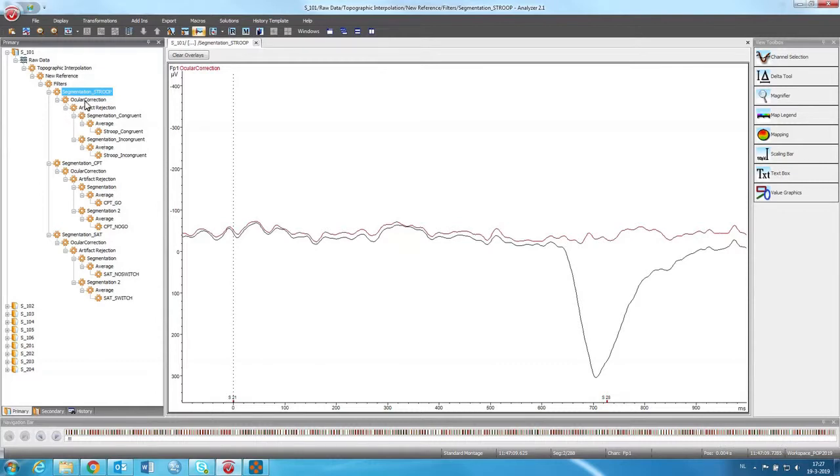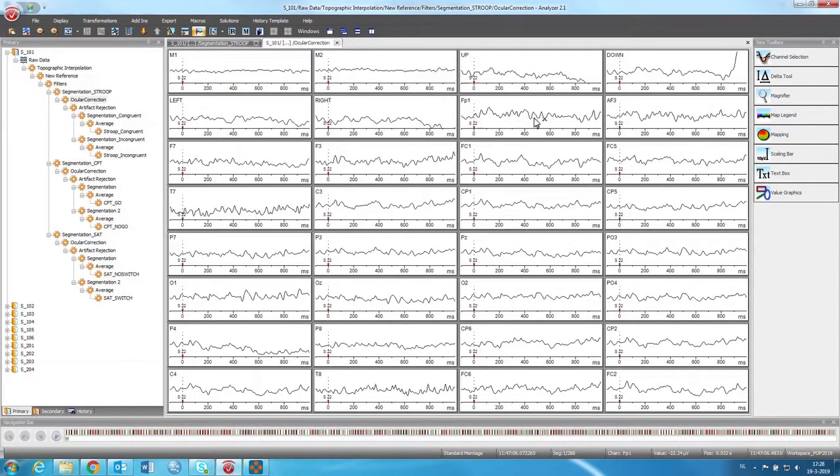So after this is done, we can click on this. We get the same thing, but now all the eye blinks are removed from the data.